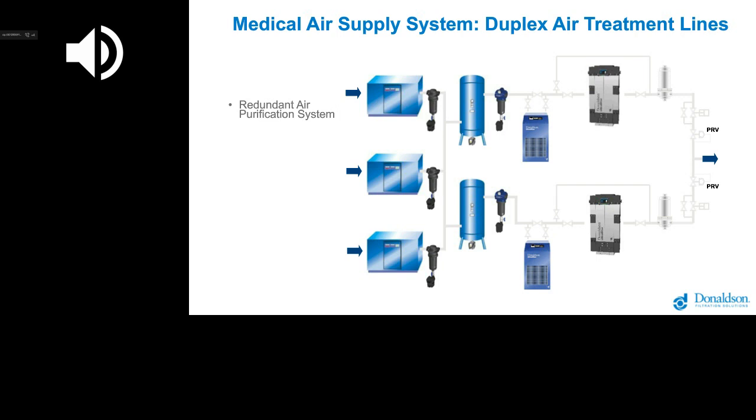That means, as I said before with the air bottle, the third compressor is always in place in case one compressor is in maintenance and the other one is running, and you get in trouble with this running compressor. What we can see also in ISO 7396-1 is that there is a requirement to have a pressure dew point and CO measurement in place.